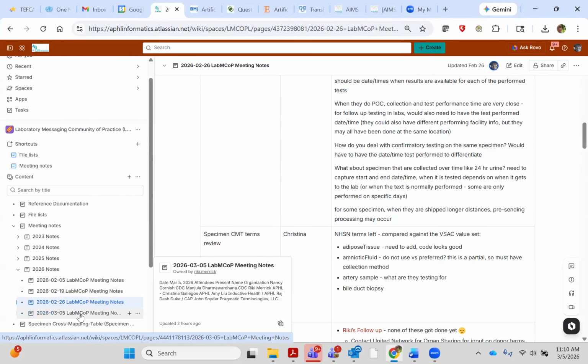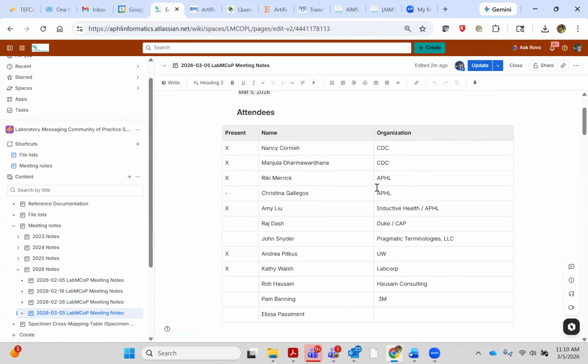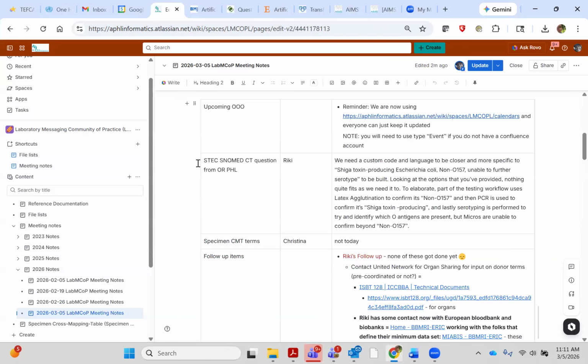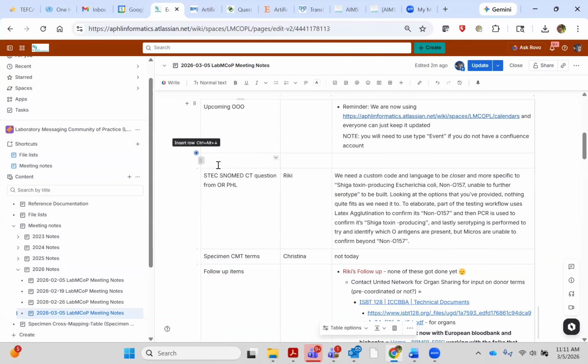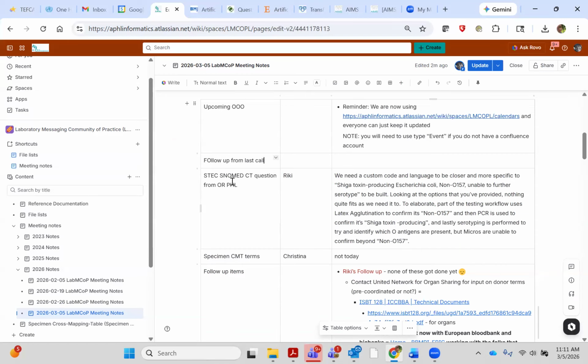For add-ons too, we would go look up, sometimes pulling a CBC tube if they want to add on something like an A1C or BNP that you could spin down. In those cases, you would have the original specimen collection date and time. It was already in the lab.